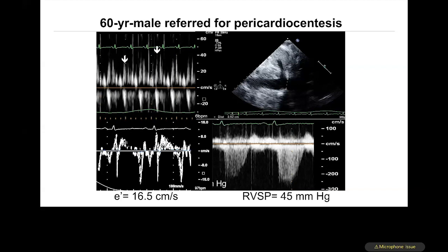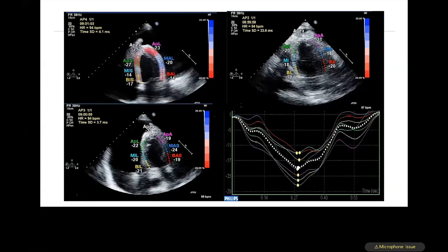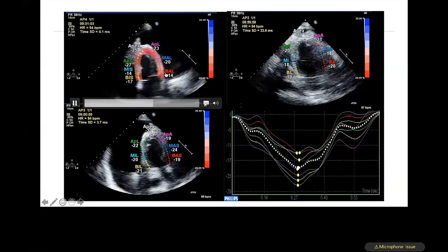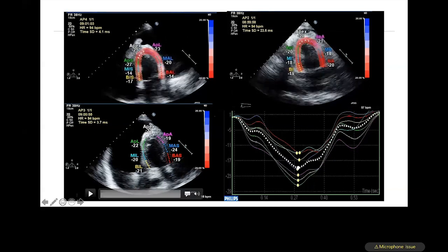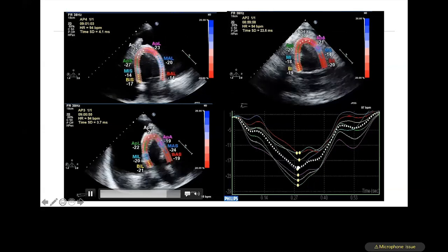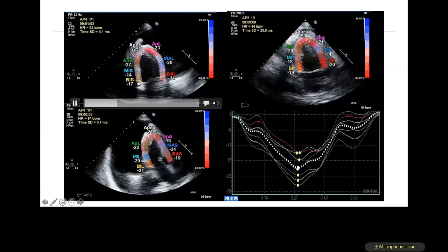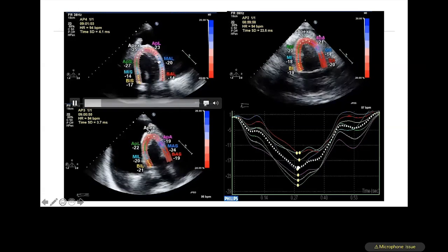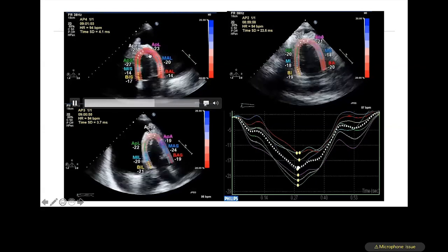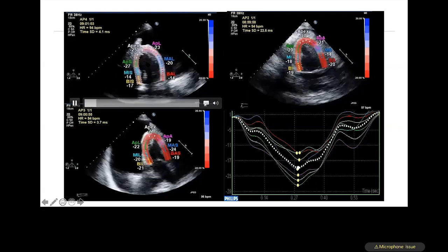So we went ahead and did an additional step to look into how this LV is moving. Now you can see here, this is speckle tracking echocardiography from the lateral side to the septal side, and this is all information. Interestingly, this LV is attempting to squeeze in a longitudinal direction. Longitudinally, it is trying to contract and expel and create a stroke volume in a constrained environment.